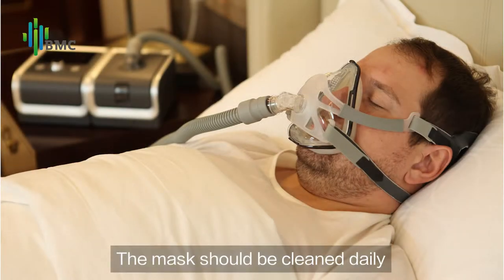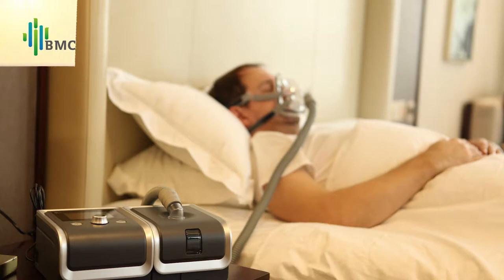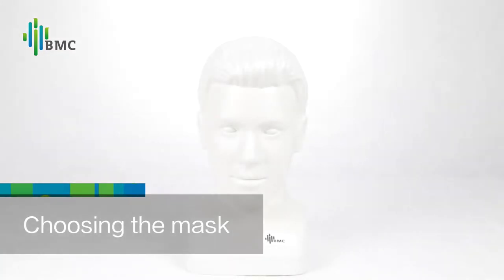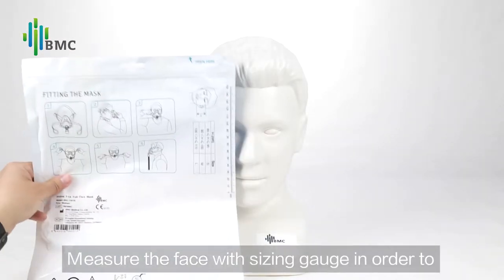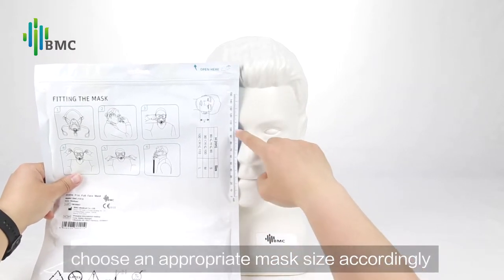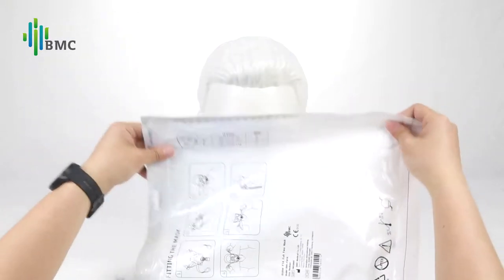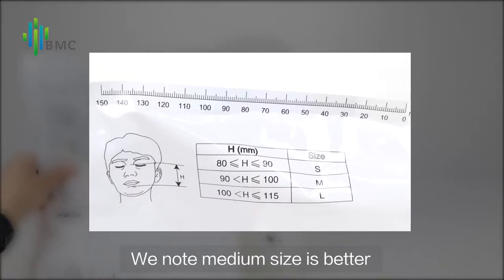The mask should be cleaned daily and replaced every six months. When choosing the mask, measure the face with the sizing gauge in order to choose an appropriate mask size accordingly. Note that medium size is generally better.